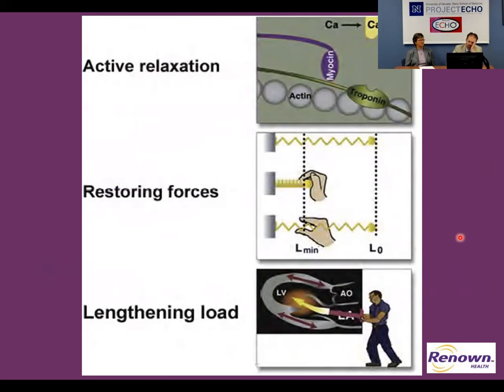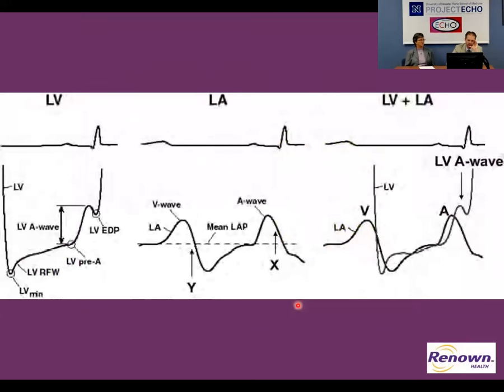But let me go in, before we talk about questions, to some diastolic function parameters. And again, as we were talking about earlier, myocyte relaxation is the energy dependent step. And so what we're measuring with diastolic function is how much force it takes to get blood into the left ventricle. And usually that should be a very compliant chamber, but not always.